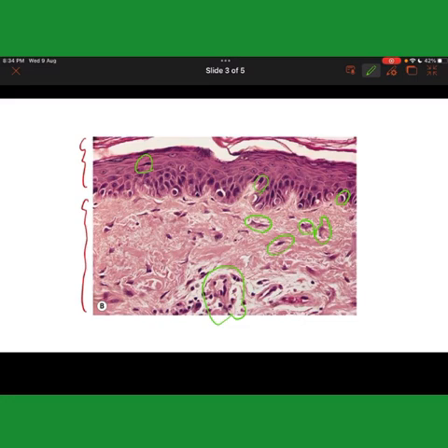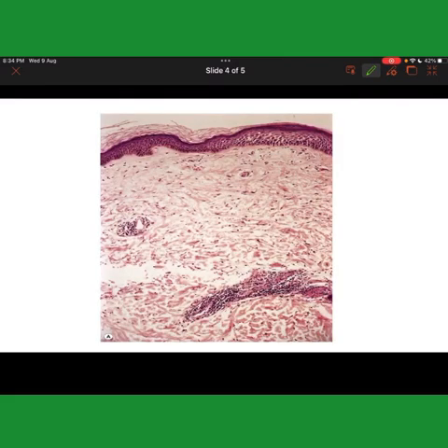As you can see, there is a mild focal inflammatory infiltrate hugging these vessels. If you notice very clearly, the inflammatory infiltrate is sparse, but as you move deep into the dermis, you find the inflammation moving very deep. So there is a deep inflammatory infiltrate as well as deep elastotic fibers. We see these as elastotic fibers. They look like corrugated elastin fibers. That's why we call that solar elastosis.